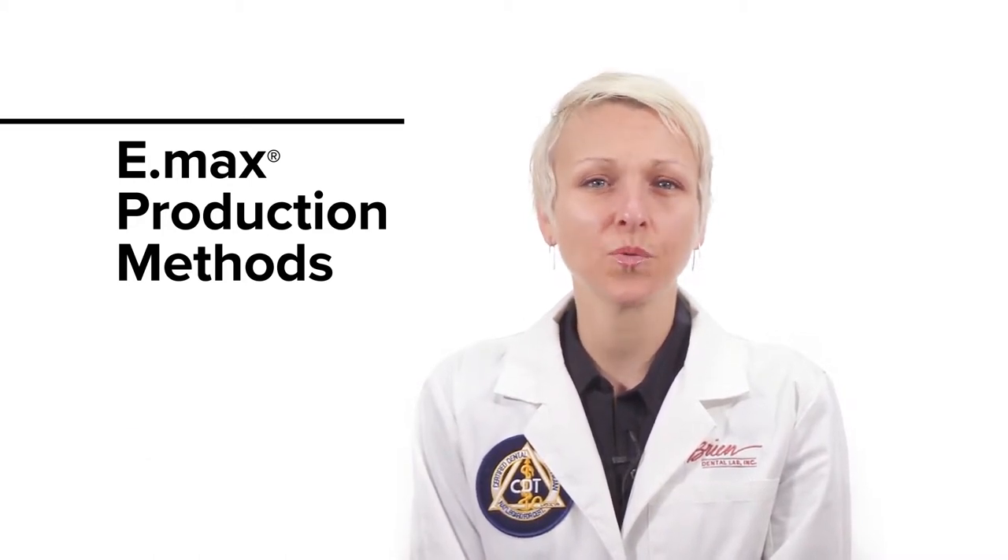Hello, I'm Carly from O'Brien Dental Lab. Emax restorations have become extremely popular in the last several years, and in this video I'm going to talk about the two production methods for Emax and how they differ.